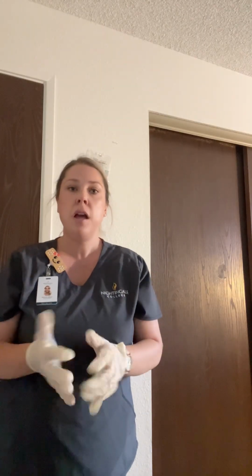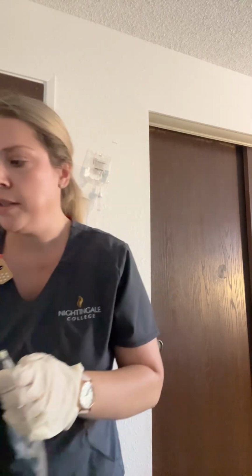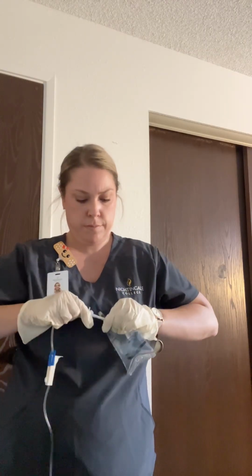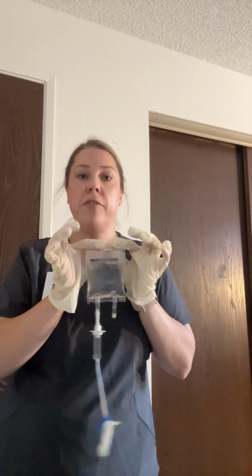We want to make sure, again, our patient is not allergic to any medication. So before we give our medication, we want to just, again, verify that the patient doesn't have any allergies. So like with the first bag, we want to spike the bag, making sure our roller clamp is closed again. Okay. So for the piggyback, we want to make sure we hang it above our primary bag. So we're going to go ahead and do that.